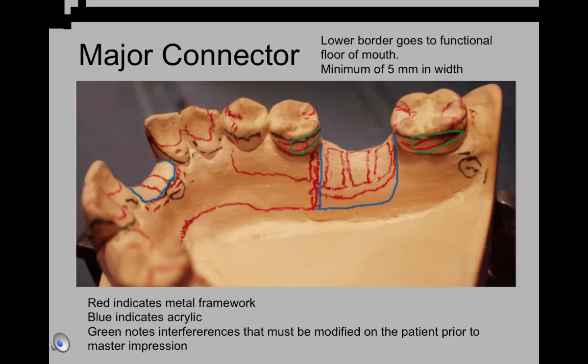When the tooth is lost, then a reline can be done to your denture using that base attachment that's already present for retention, and the base can be extended to cover the retromolar pad and to add another additional tooth in that area. This is not possible when the major connector is carried posteriorly, as in the previous slide, number 23.